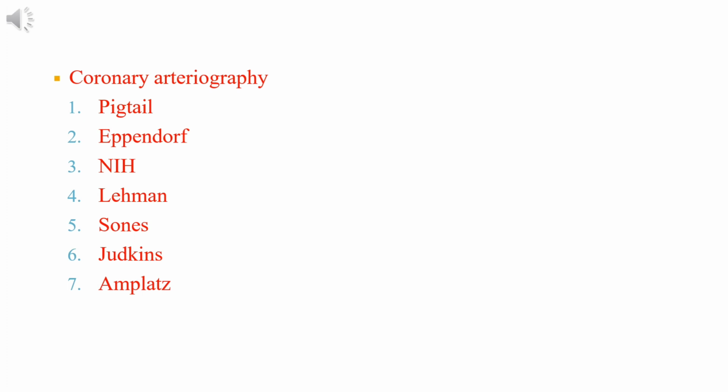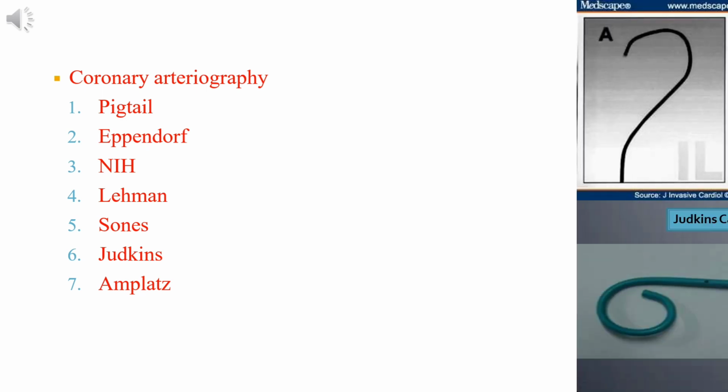We have some of the coronary arteriography catheters. They are Pigtail, Eppendorf, NIH, Lehman, Sones, Judkins, Amplatz.